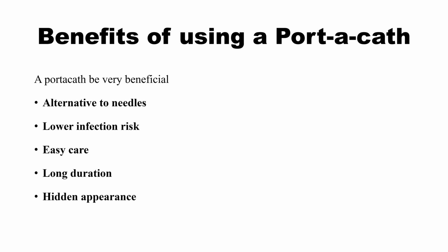Benefits of using a Portacath. A Portacath can be very beneficial for the following reasons. Alternative to needles. Portacaths bypass the pain and potential risk of using needle sticks for every treatment or blood draw. Low infection risk. Portacaths carry a lower risk of infection than other IV methods. Easy care. People generally find that they are simple to care for at home. Long duration. Portacaths stay usable for a long time. Hidden appearance. Portacaths are not noticeable as they sit under the skin.